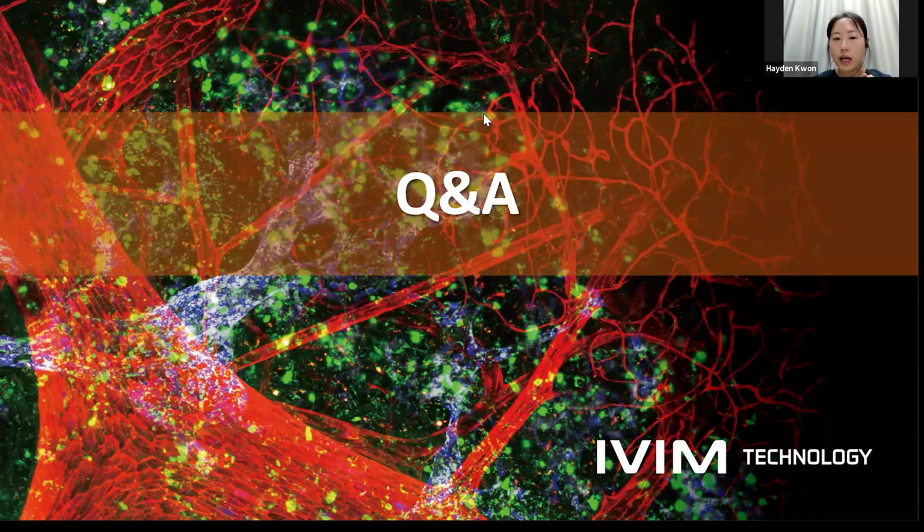And also, if you administer the labeling kit, the fluorescent signal stays over several hours, for example, from 6 hours to 24 hours. So for one-time imaging, just one administration of the labeling kit is enough. But if you are trying to image several times repetitively, like at several days or a month interval, maybe you could inject again before the imaging.